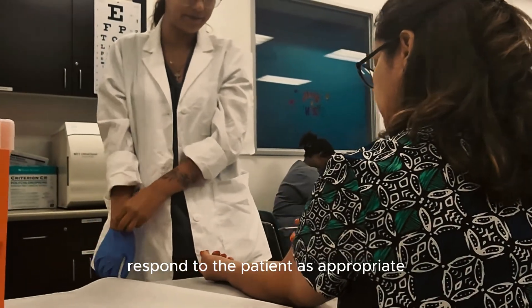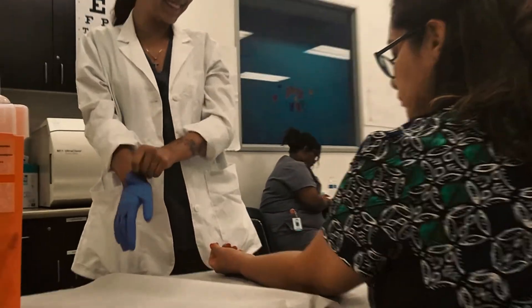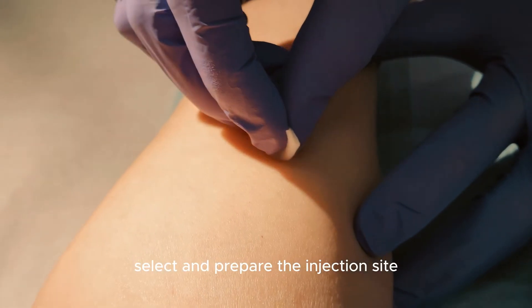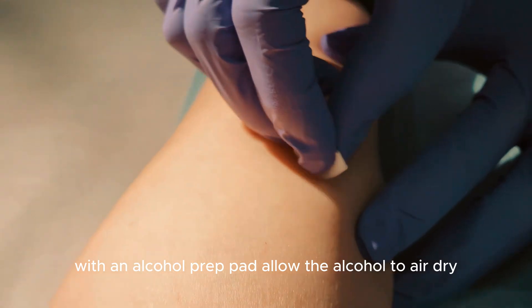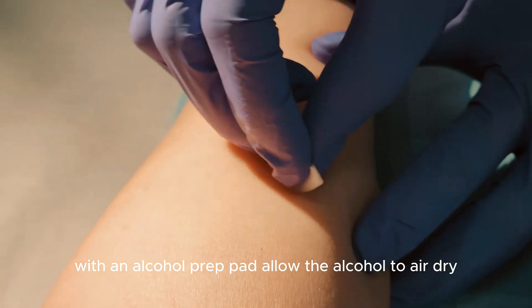Respond to the patient as appropriate. Select and prepare the injection site with an alcohol prep pad, and allow the alcohol to air dry.